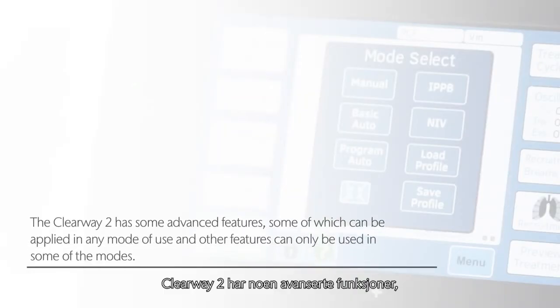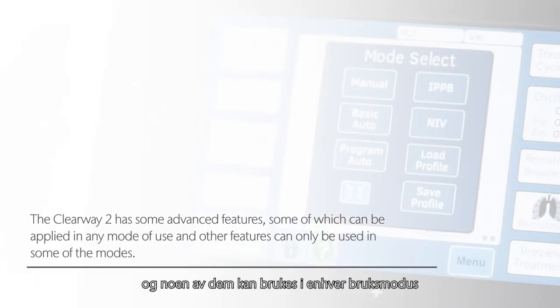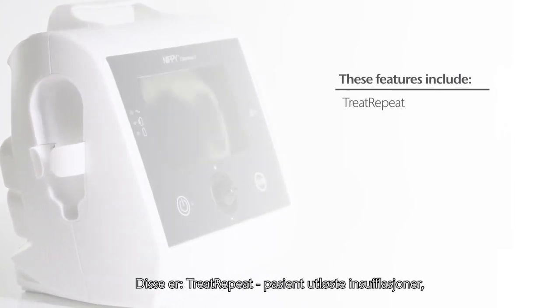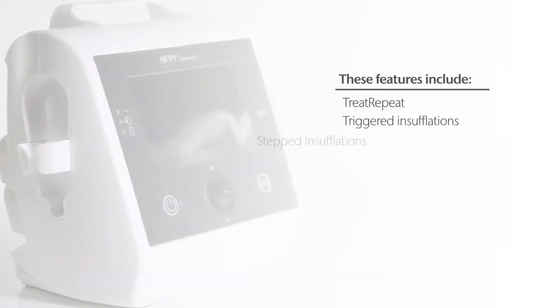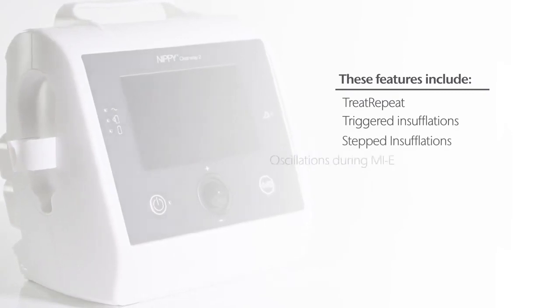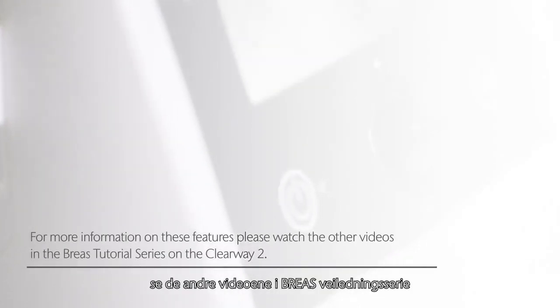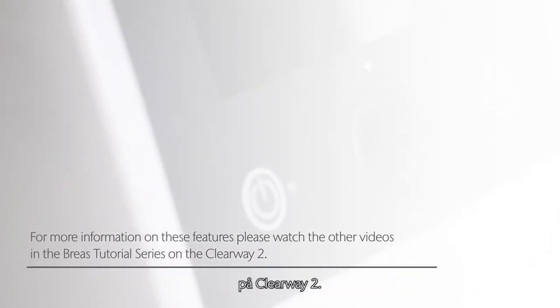The Clearway 2 has some advanced features, some of which can be applied in any mode of use and other features can only be used in some of the modes. These features include Treat repeat, Triggered insufflations, Stepped insufflations, and Oscillations during MIE. For more information on these features, please watch the other videos in the Breas tutorial series on the Clearway 2.